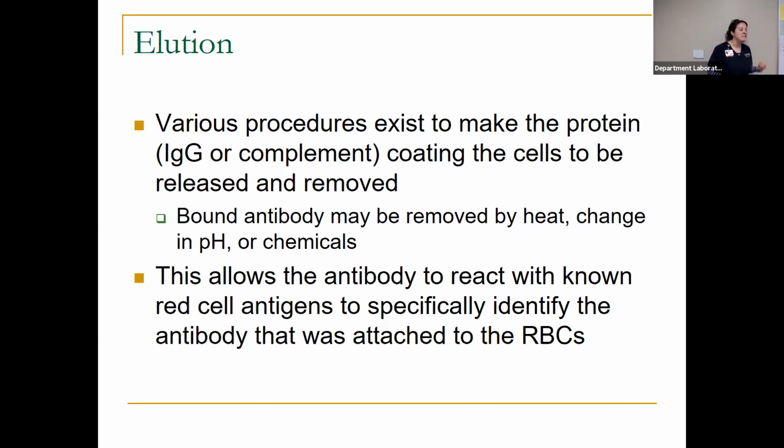And what we're trying to do in this elution, there's an antibody or complement coating patient cells, correct? We want to break that antigen antibody complex. We're going to dissociate the antibody from your patient cells. Okay, and we can do that through heat treatments.